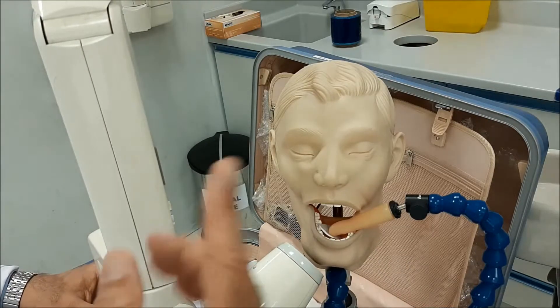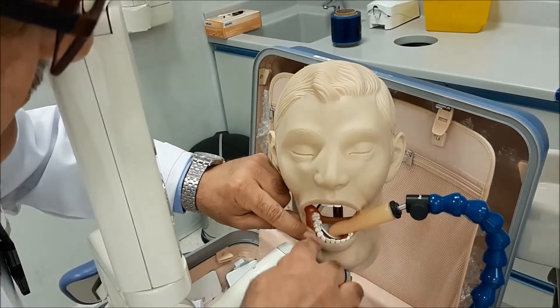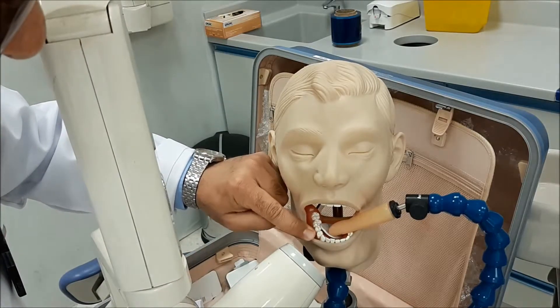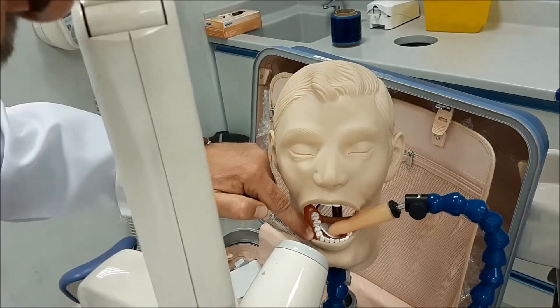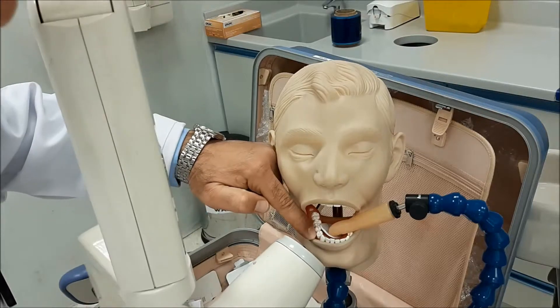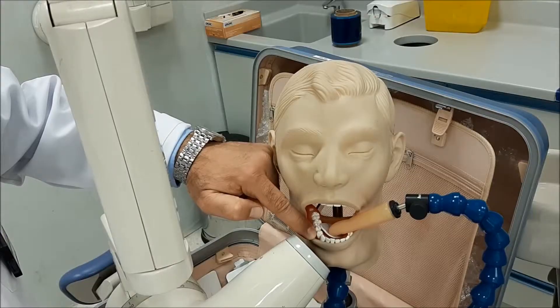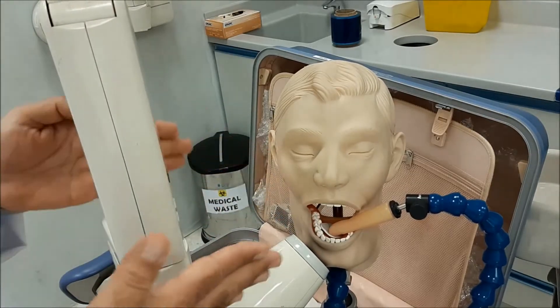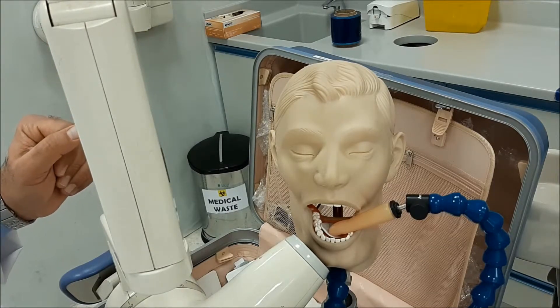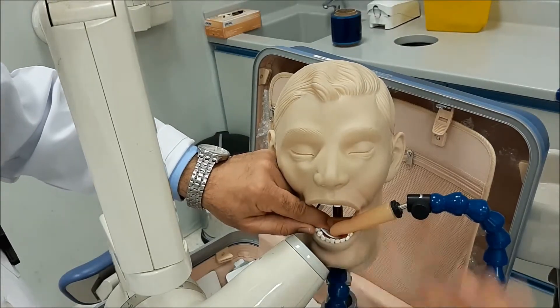The other things to check are horizontal angulation and coverage. For horizontal angulation, you simply make the X-ray perpendicular to the buccal surface of the tooth. If you come from the wrong direction, you will end up with overlapping margins. With the vertical angulation fixed, direct the beam so that it is perpendicular to the buccal surface — this will make the X-ray pass between the teeth and you will end up with separated contact points in the image.